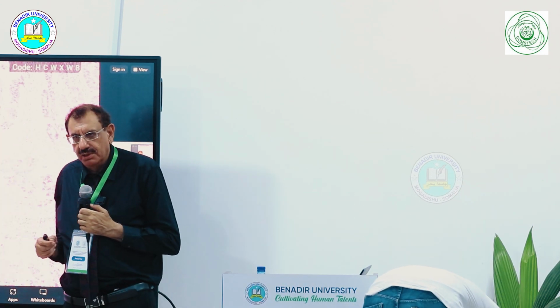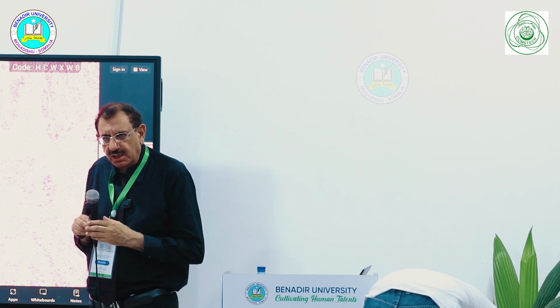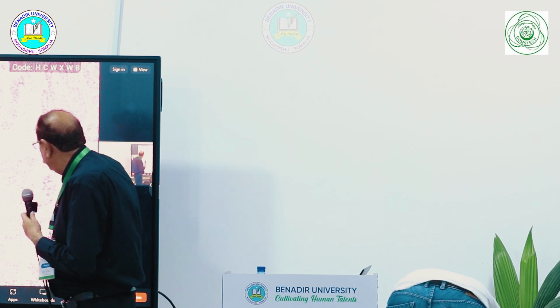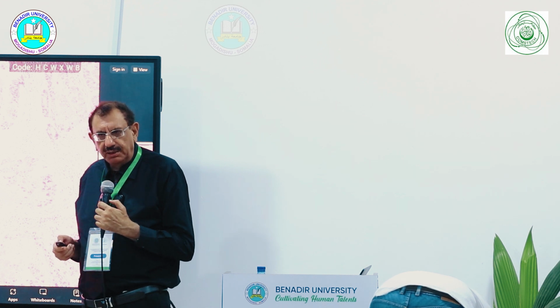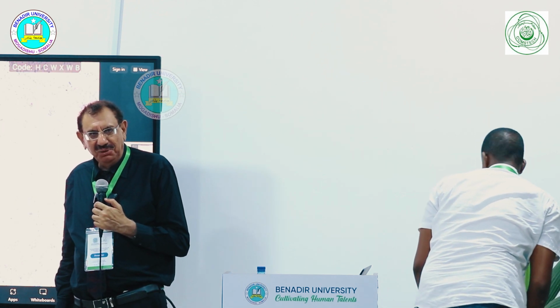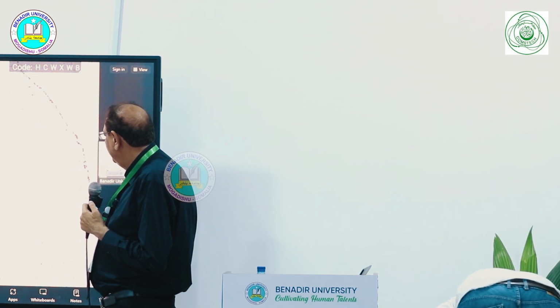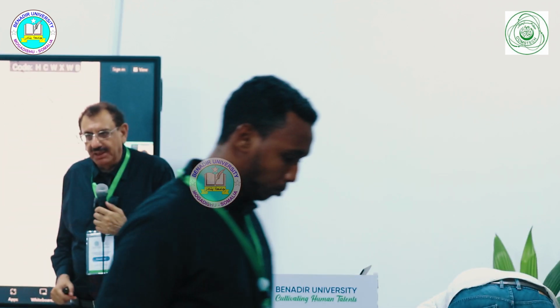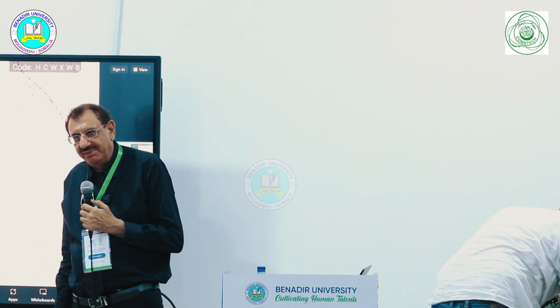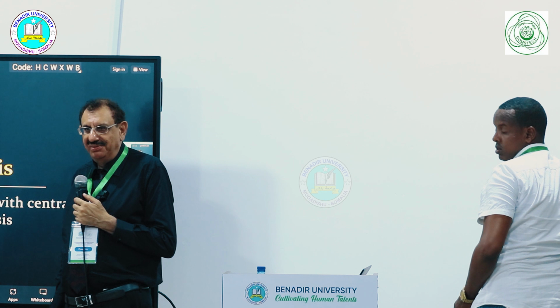This is another case, very similar. Again, the trainee brought this saying it shows extensive ductal carcinoma, comedo type in situ, and I'm not sure if there is any invasion, maybe somewhere here. But I said, okay, let's first get the myoepithelial staining, and there is no myoepithelial staining because there is no myoepithelial layer, right? Where you genuinely have ductal carcinoma in situ, you always have the myoepithelial layer, right? So what we were looking at is infiltrating carcinoma breast with central comedo-like necrosis.